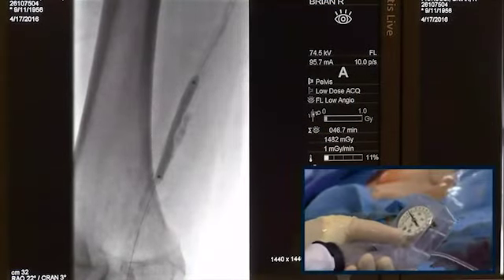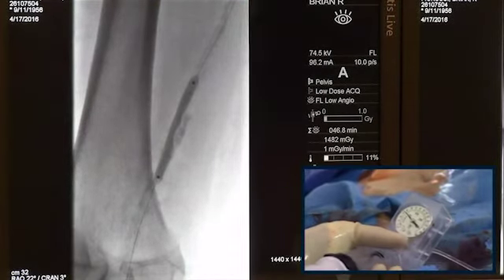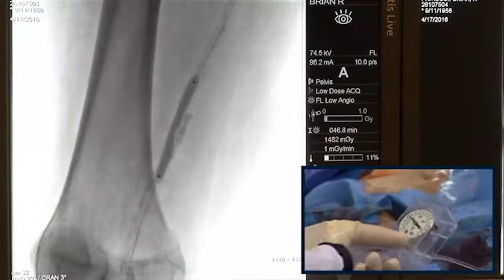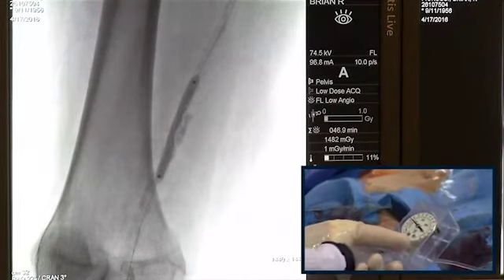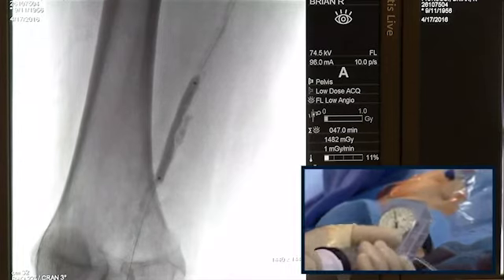Look very good in the long run. So the outcome is pretty convincing. Also, the data we gained from the Impact Global registry, we enrolled a lot of this kind of patients into this registry, where we performed provisional stenting in areas like this, and the remaining vessel remained without stent.